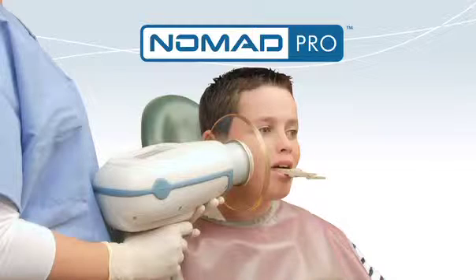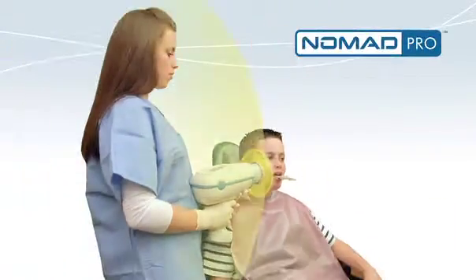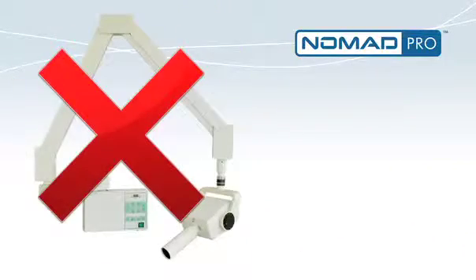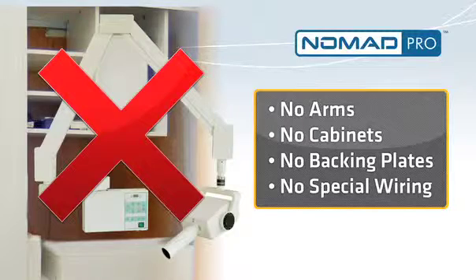Nomad Pro is proven safe. The backscatter protection shield is made from lead-impregnated acrylic that blocks radiation reflected from the patient. There's no need to leave the room to take an x-ray, and there are no clumsy arms, pass-through cabinets, backing plates, or special wiring required.